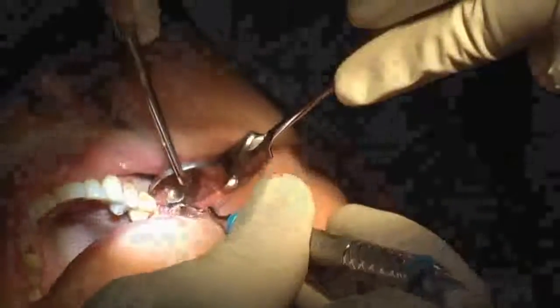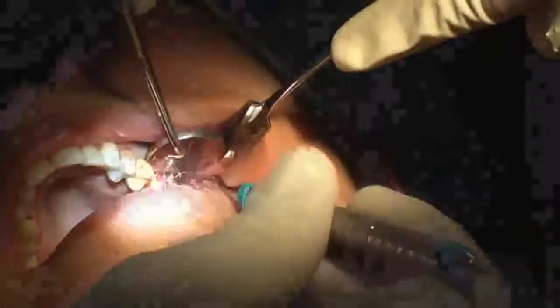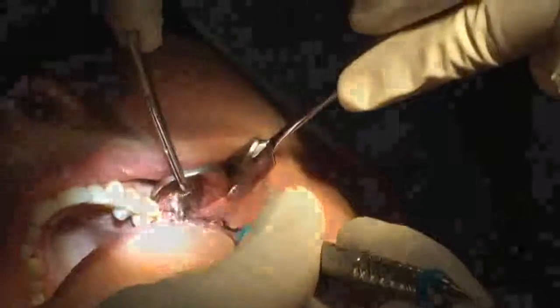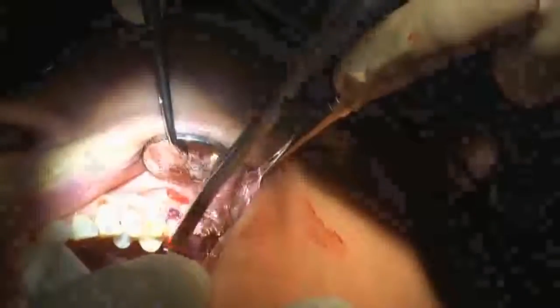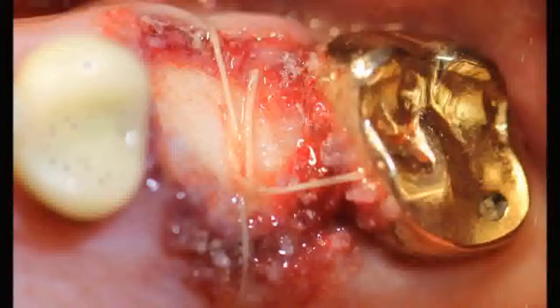After suturing everything in and everything is solid, I'll go in and trim off any excess Periacryl from the adjacent teeth. Here you can see the final product being rinsed. If you have any strands of Periacryl left after application, you can simply trim them off with scissors. You can see the Periacryl rimmed around the border and bonded to the gingiva.